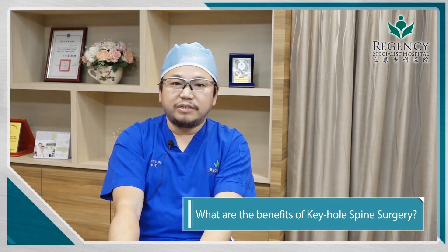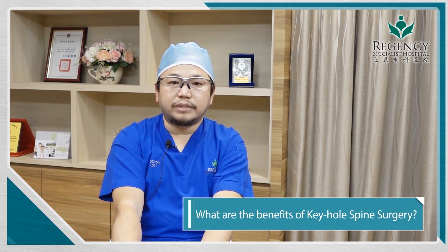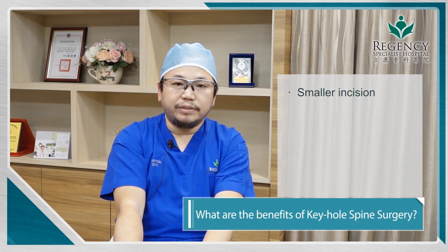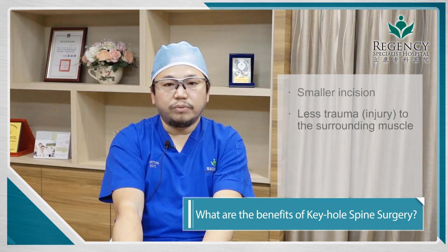Minimal invasive discectomy has five key benefits compared with the conventional way. Firstly, we can make a small incision. Because of the small incision, we can cause less trauma to the muscles. Because of the less trauma to the muscles, we can have less postoperative pain.